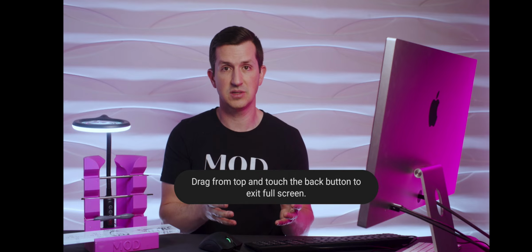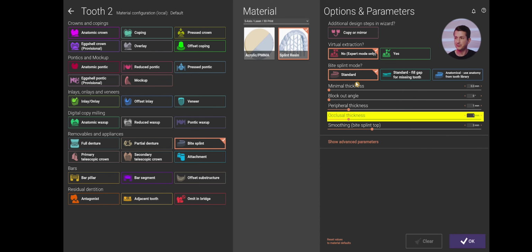scheme built into that appliance, and then you would be able to overlay that, deliver it so that it fits on the patient's current teeth, and you could have them wear it for whatever period of time fits your philosophy for doing a full mouth rehab and having a patient acclimate to some type of new bite. It's not something that I personally believe in. It's not really that well supported in the literature as far as the necessity to do that. But if you want to do that, that is the module that you would use.